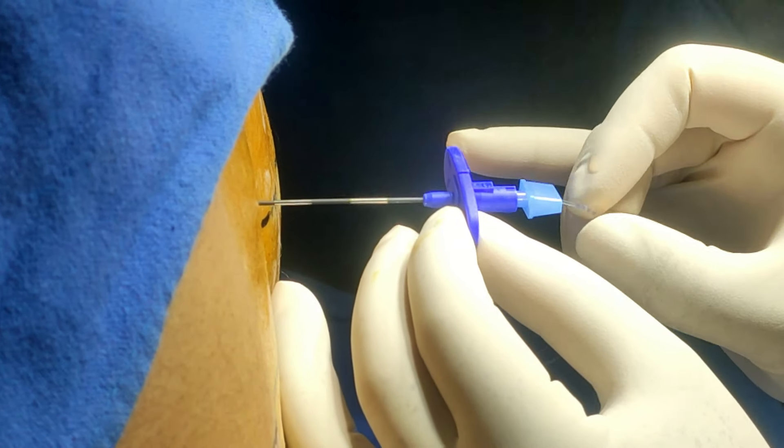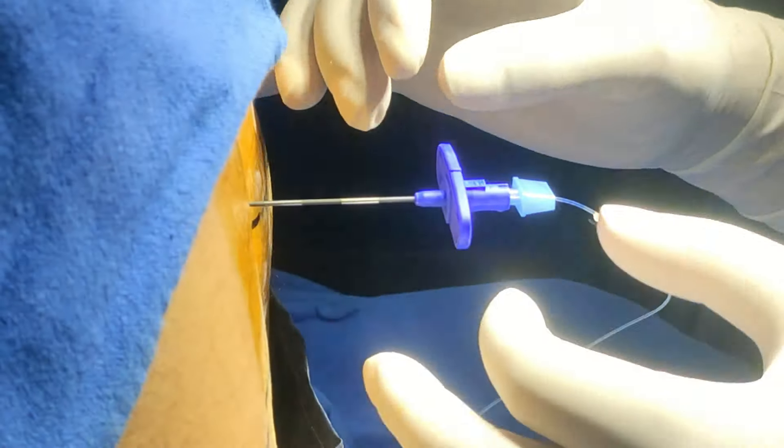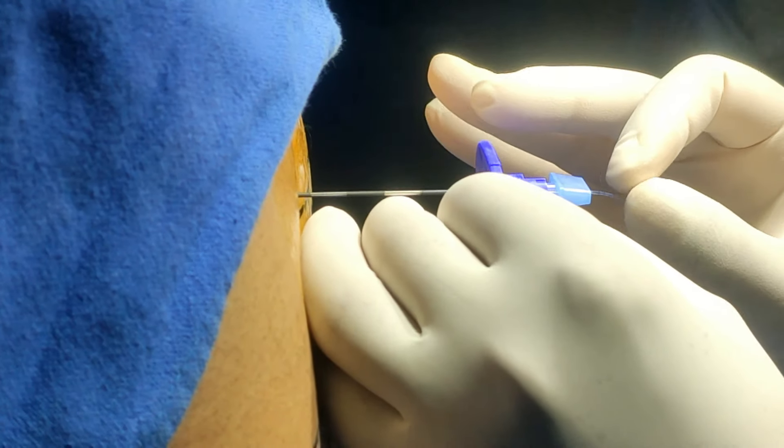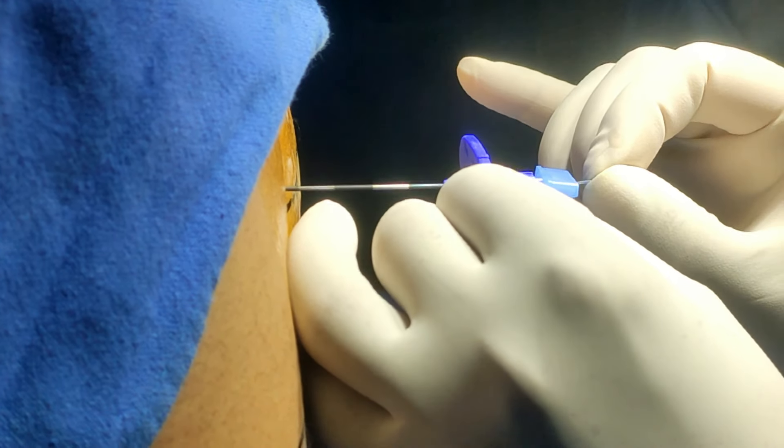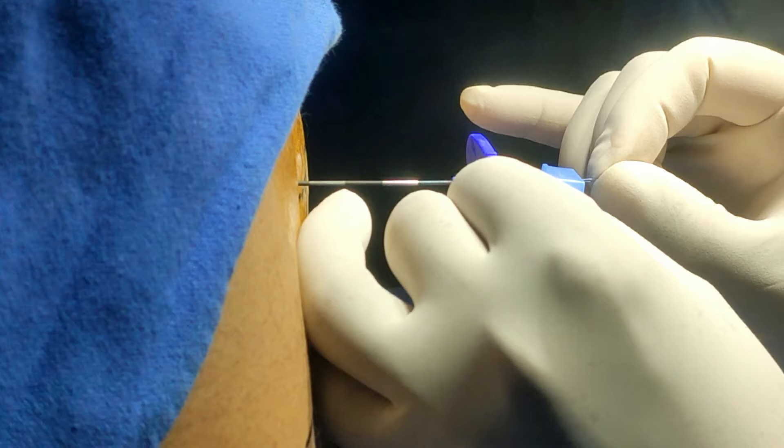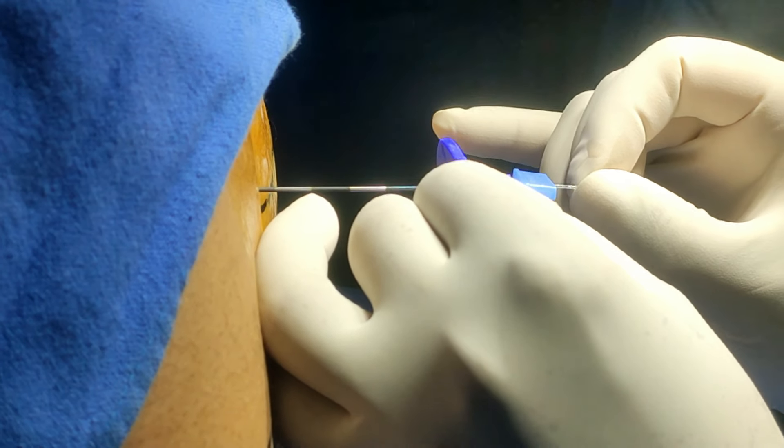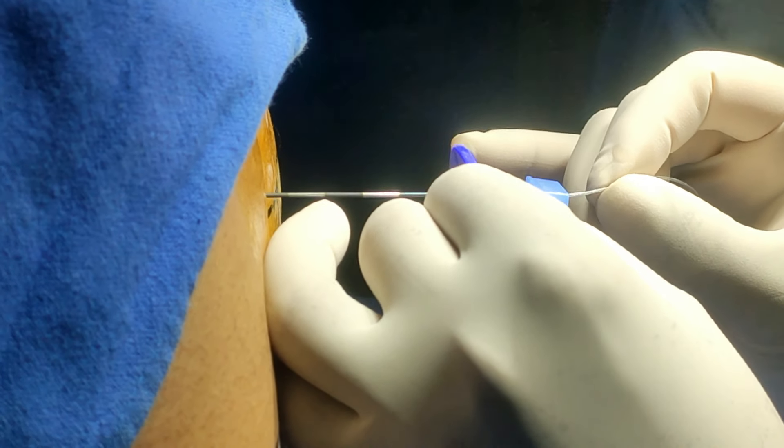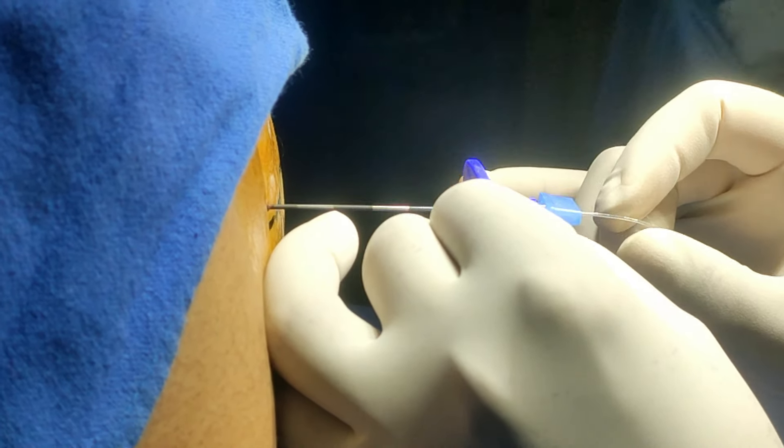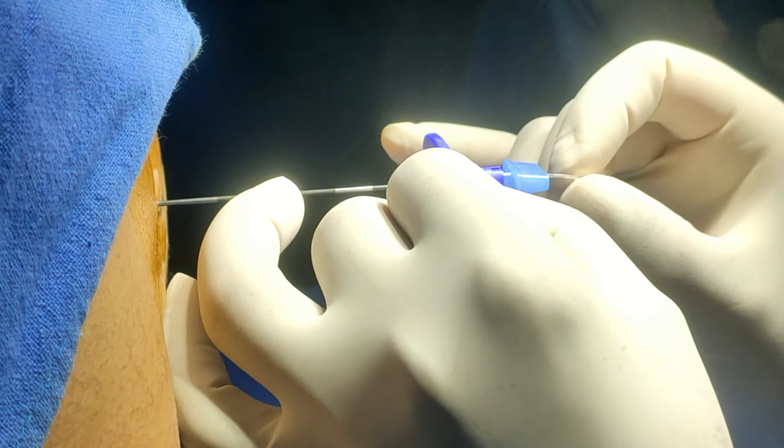Now it has gone. Now I will remove the needle while keeping the catheter in place, pushing it inside. Just remove the needle, keeping the catheter inside. Yes.